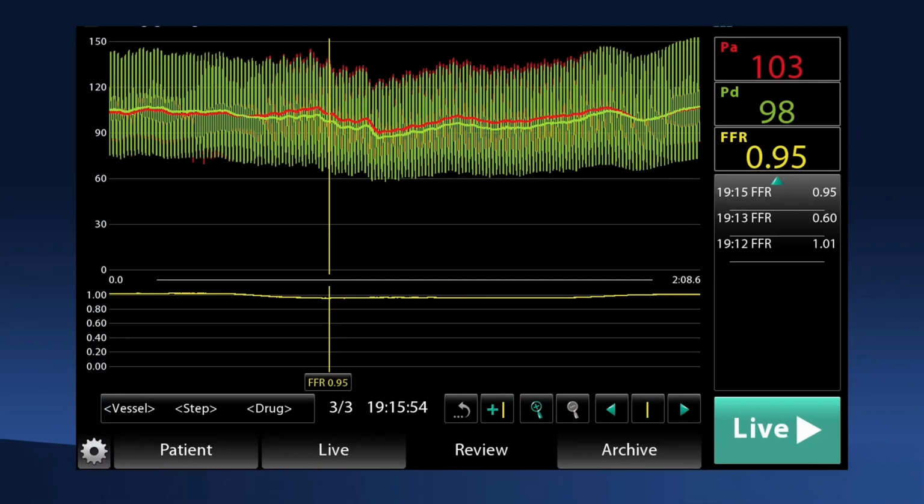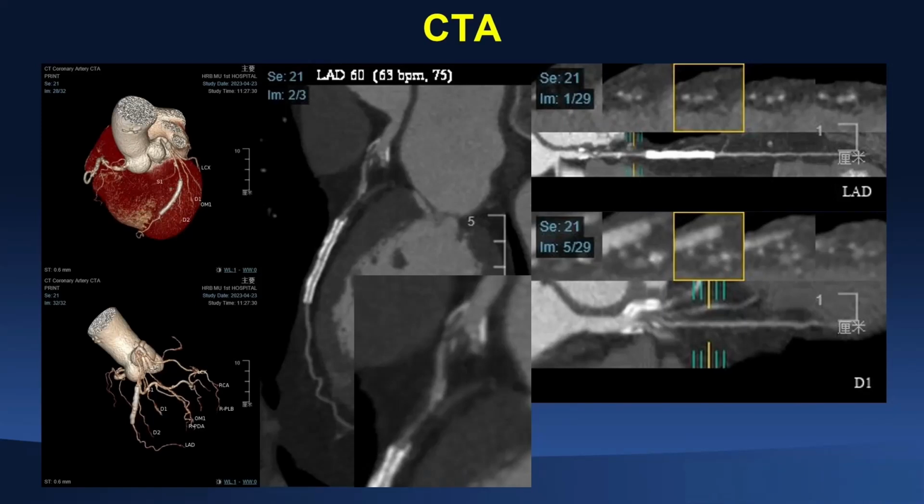Here, we also did the CTA in our hospital, and we can see the proximal LAD image is blurry, and it is difficult to evaluate the plaque feature, even when the image has been magnified. In this situation, it is impossible to make a detailed PCI plan before the procedure, especially in some CTO cases.